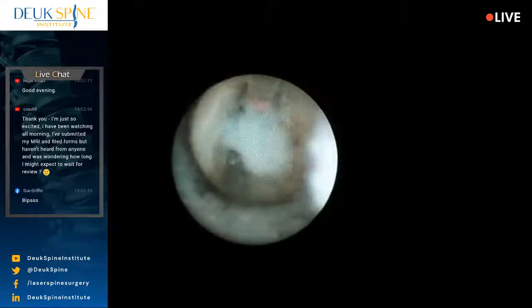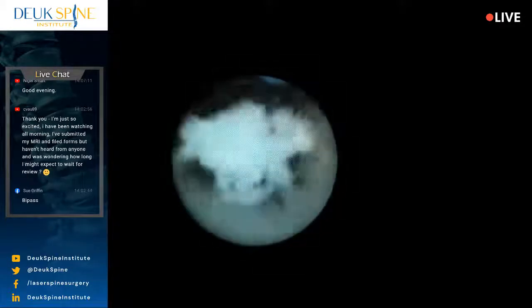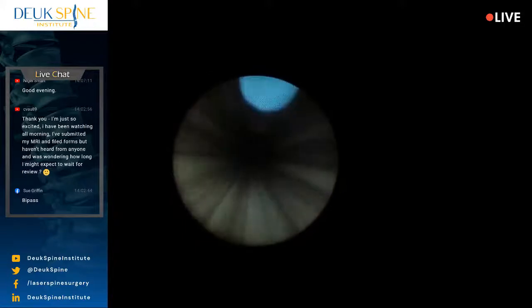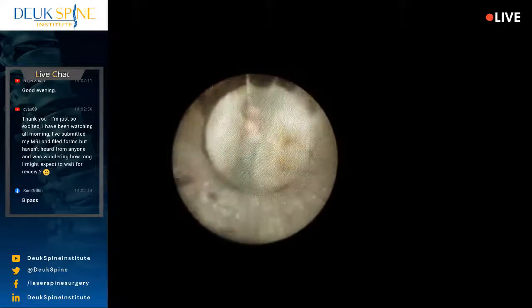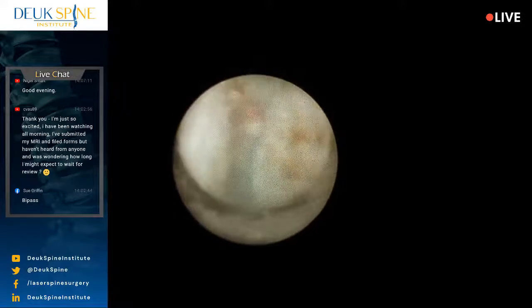Oh yeah, baby. That's herniations right there coming out of the foramen. That's what was pushing on her nerve to her arm. And that's pretty much it. It looks good. We're done.